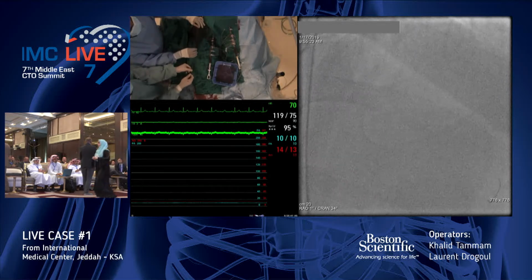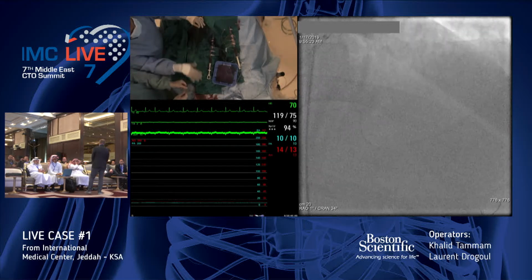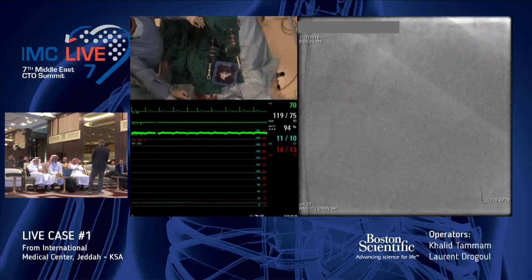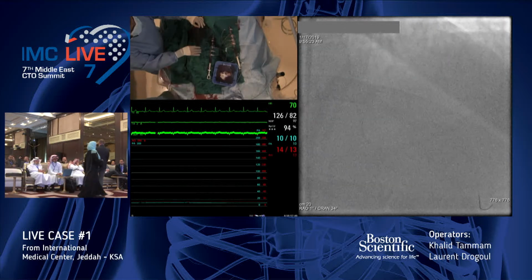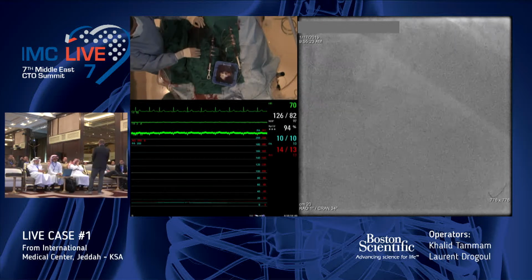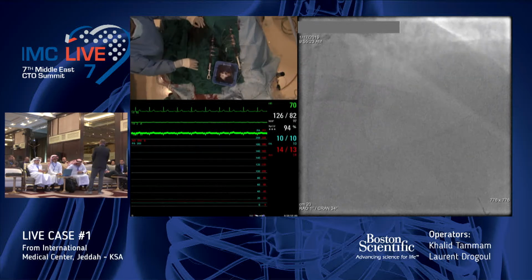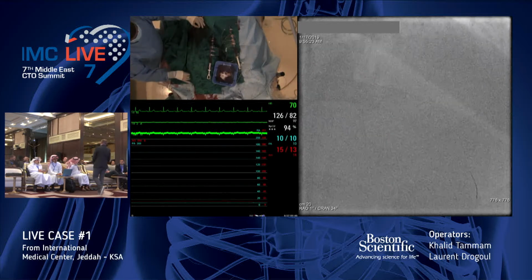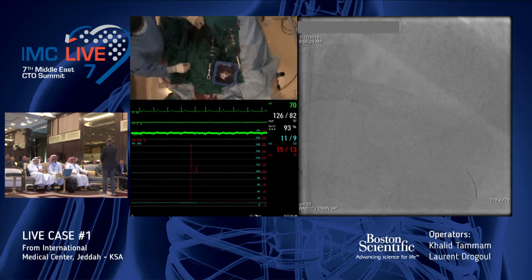Is it sufficient to use, for example, a high pressure non-compliant balloon or a cutting balloon rather than rota, since it is not complete? Or what is the cutoff range of calcium which would determine the choice of debulking procedure? Okay, so maybe Roberto will answer.